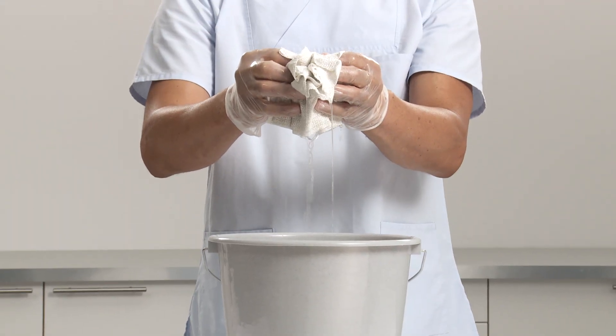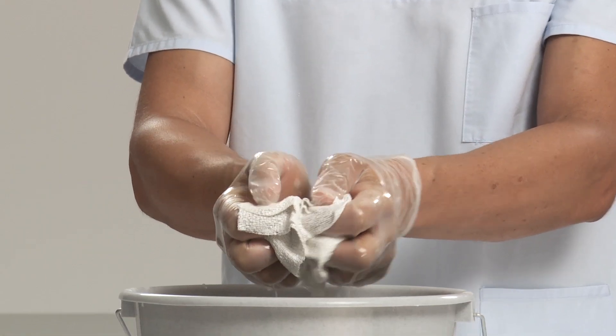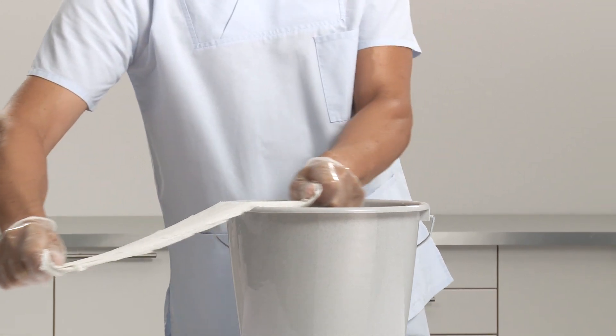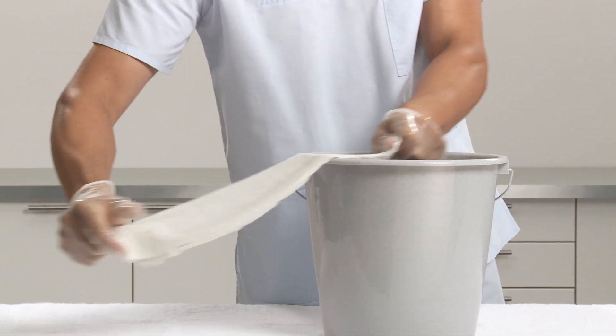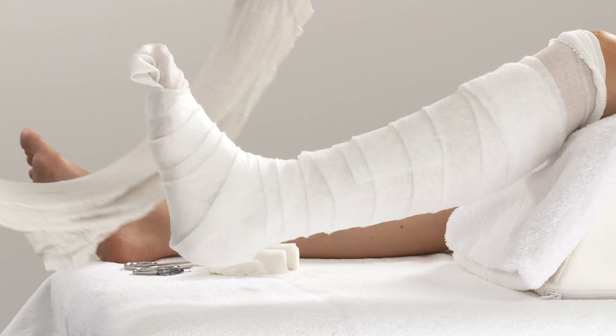Activate the splint by dipping into cool water, holding the ends, and maintaining the splint fold. Remove from water and gently squeeze to drain. Straighten out the splint and run it over the edge of the bucket to smooth and dispose of surplus water.